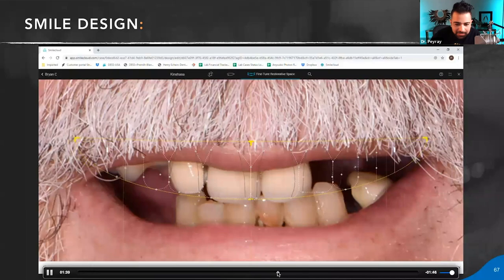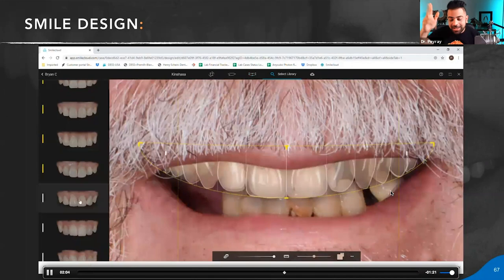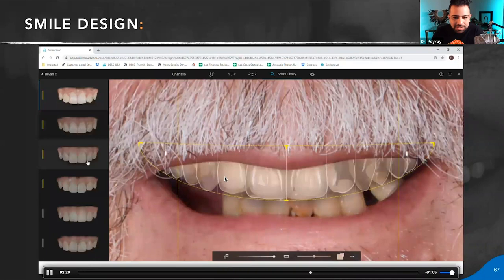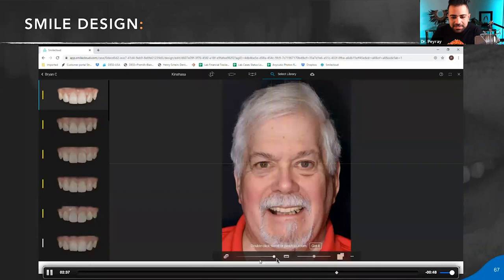So here is, for example, Brian. For any folks watching this, this is a patient where we did a live All-on-X course, and he was a patient of ours. We were just doing a smile design now that we're getting the final for him. He's done, looks amazing. On the left side, you can see there's a proposal. If you do 72%, things are going to change. The yellows are the ones that the computer is saying might match better, the white maybe, and the gray is not good. So that is a little bit about the capabilities of this. You could, again, slide them in.